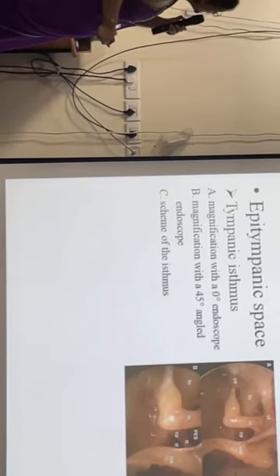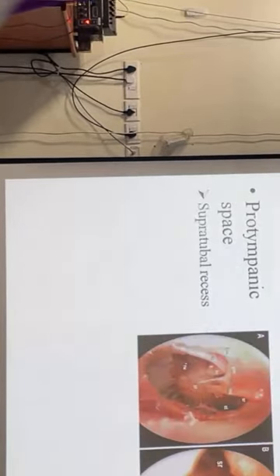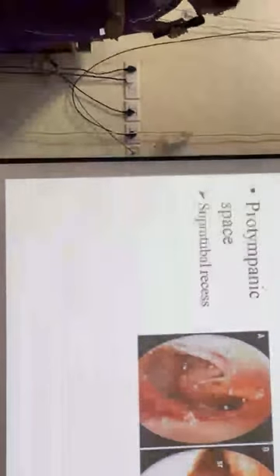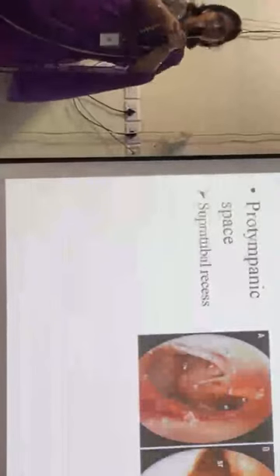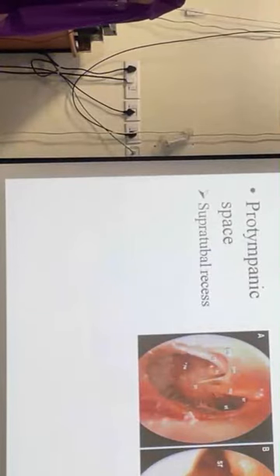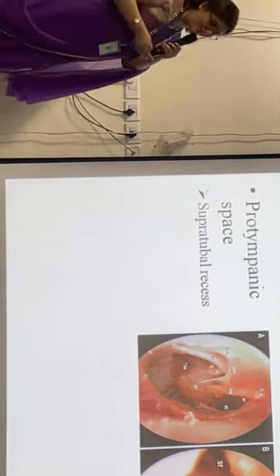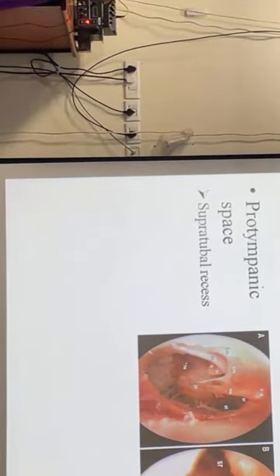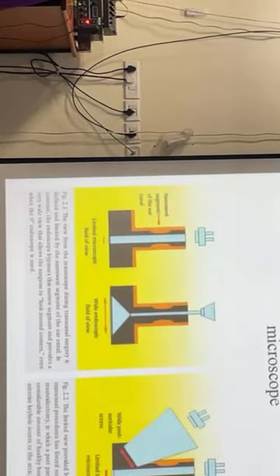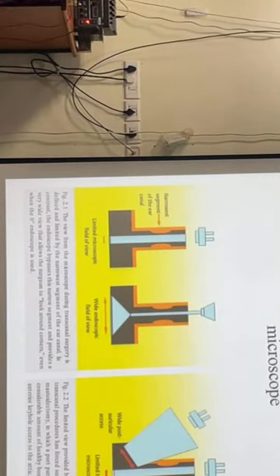Similarly, if we have to see the protympanum, the supratubal recess, the anterior epitympanum, unless we remove a good amount of bone from the anterior epitympanum, we may not be able to visualize it with a microscope. Here, with an endoscope, we are much more comfortable and sure.